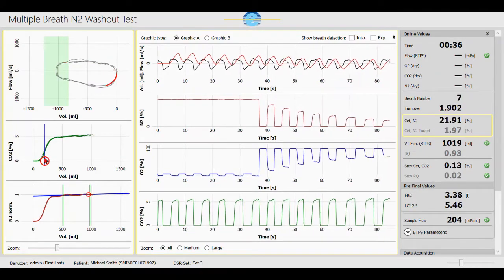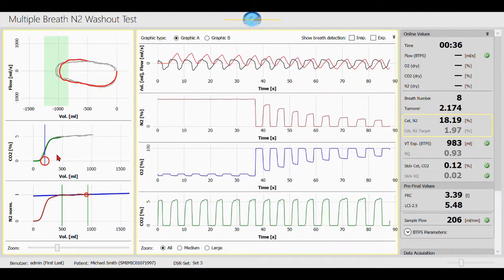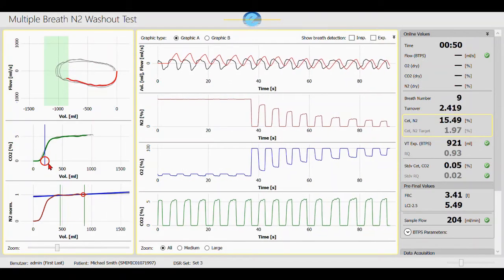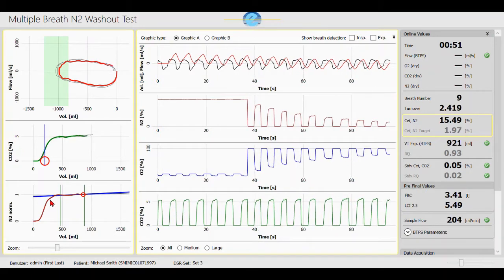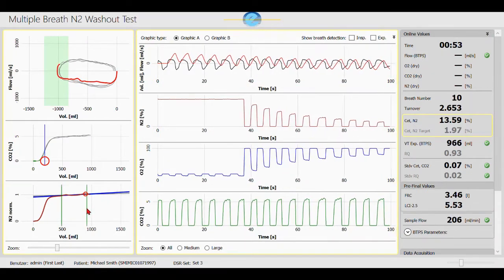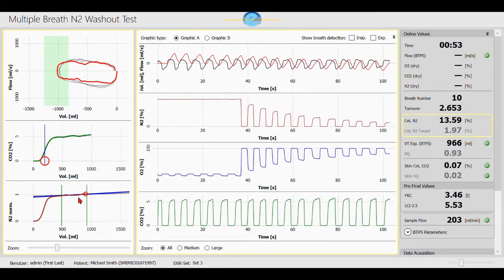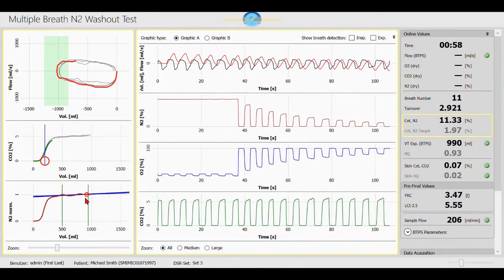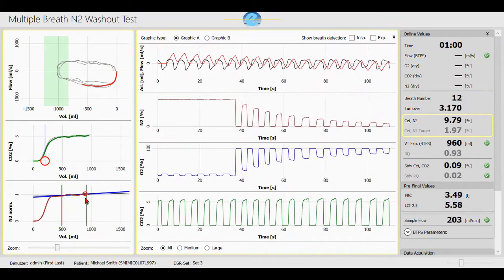Below, we have the volume capnogram, where the physiological dead space is marked with a red circle. On the bottom, you see the nitrogen expirogram, where the phase 3 slope can indicate a possible ventilatory disturbance in the small airways.